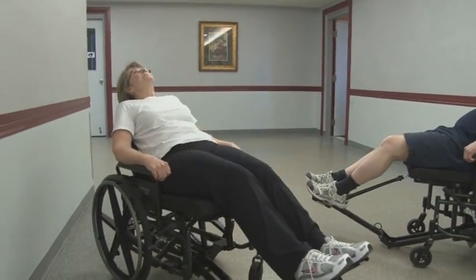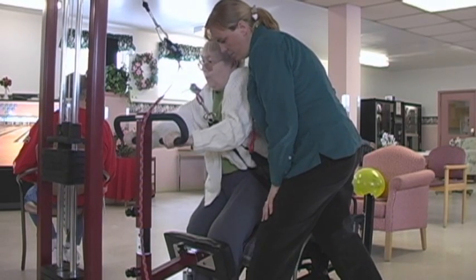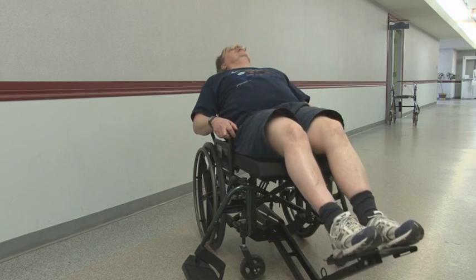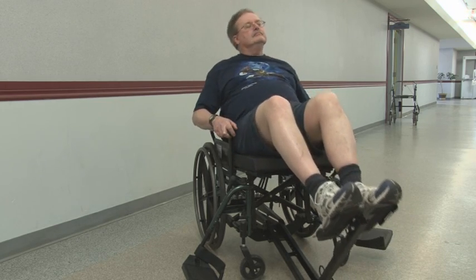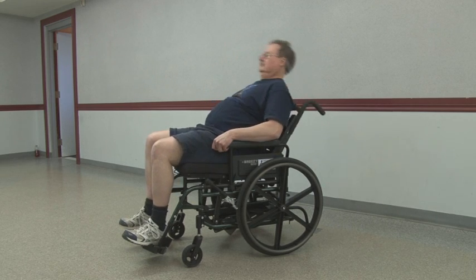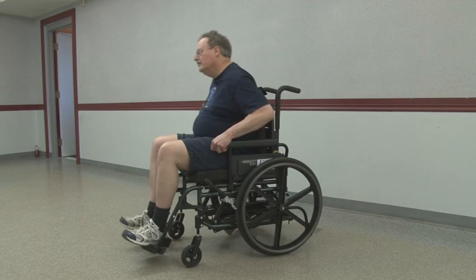The exercise wheelchair is designed to allow the initiation of movement even in extremely weak individuals. The motion trains the anti-gravity muscles of the trunk and lower extremities, targeting the same muscles used for the standing up motion. Training these muscles can improve the strength, endurance, and consequently the functional independence of the user.